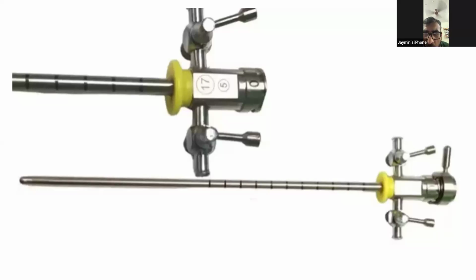And in the below photo, it is with an obturator most likely, because it is connected to the sheath with the lock mechanism. Mainly used for female cystourethroscopy, and sterilization, sir, would be ethylene oxide sterilization.